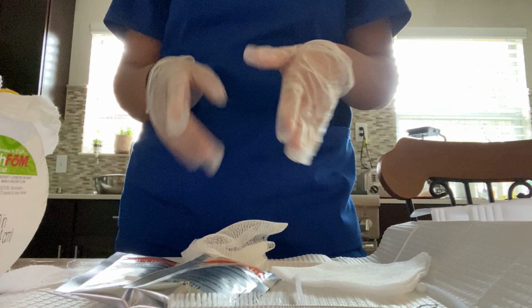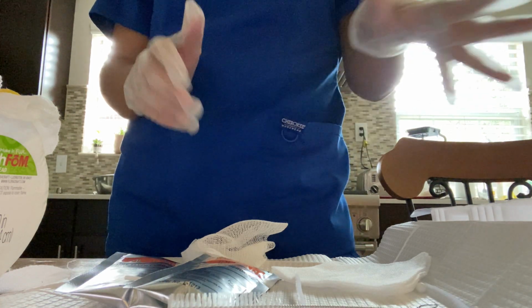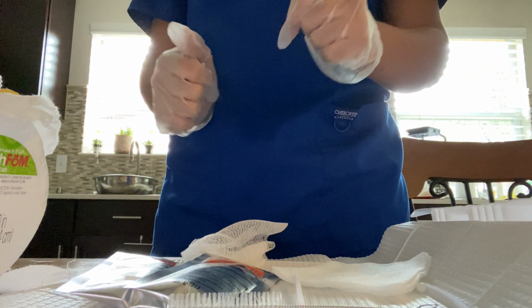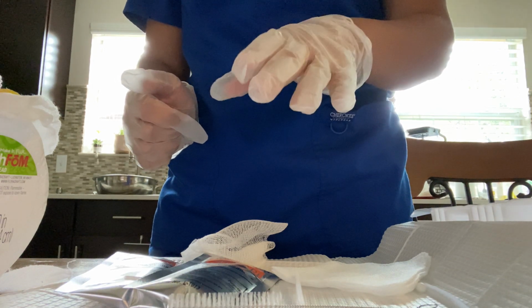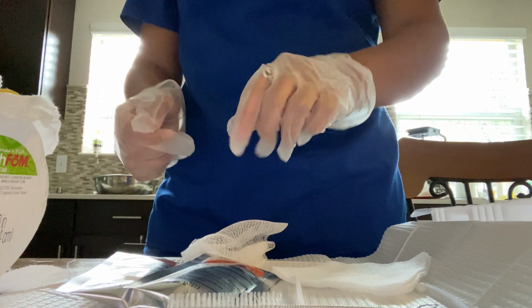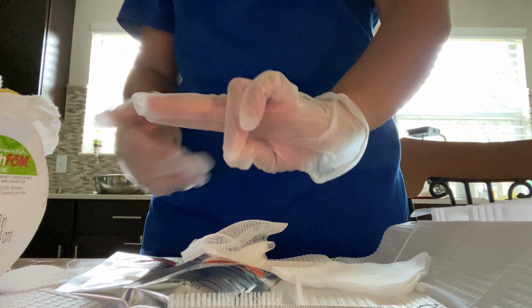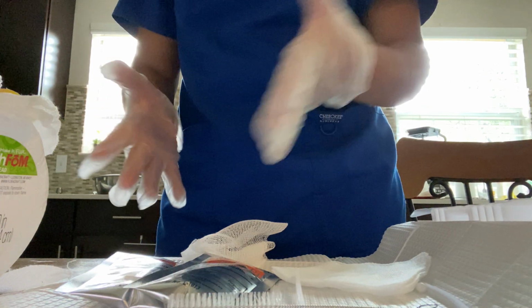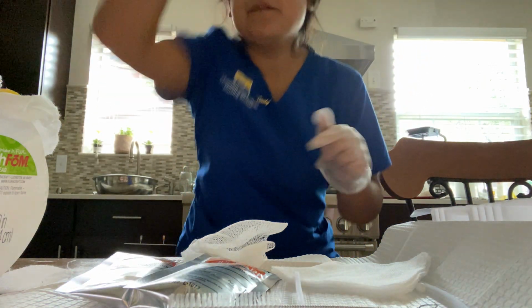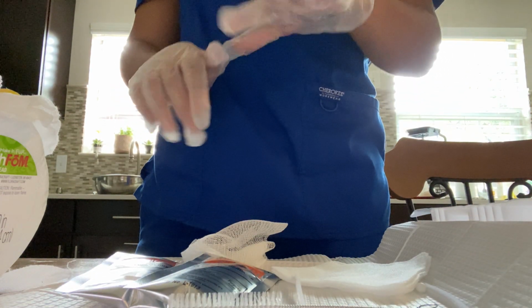Then I'm going to verbalize changing the ties because we only have one set. I'll get my new trach tie. Then I will secure the new trach tie before taking off my old one. I will then remove my old ones. And then I ensure that I have 2 fingers of space to make sure it's not too tight for the patient, because you don't want them to be uncomfortable. Then we will position the patient comfortably. Keep them in the high Fowler's position. That is very important after trach cleaning and suctioning. So you're going to want to leave them there.